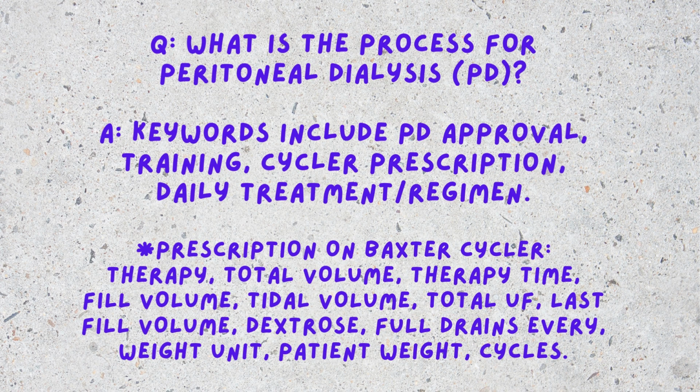And then quarterly, you usually bring in your 24-hour urine collection and the dialysis fluid collection from the night before. That would be tested in order to see how well you're dialyzing and if anything needs to be changed regarding your prescription.